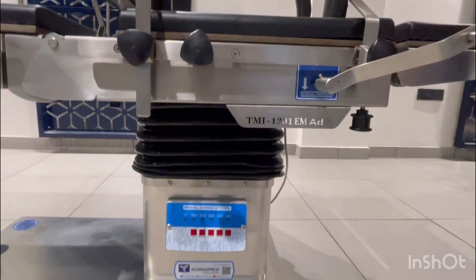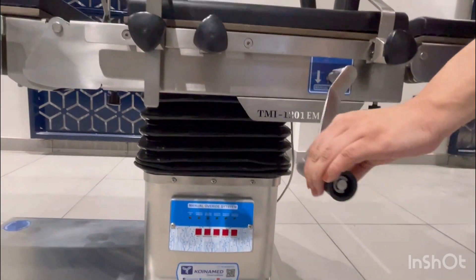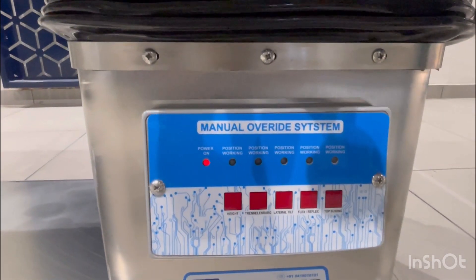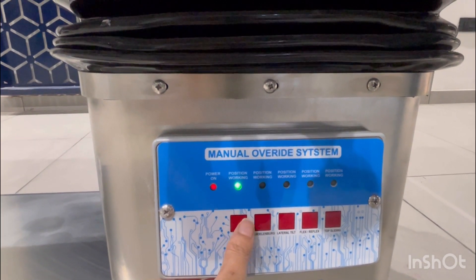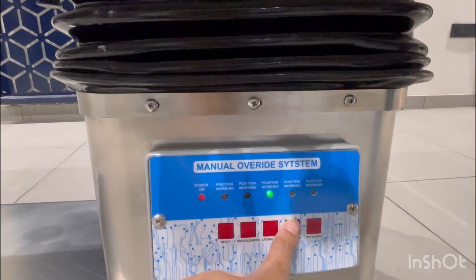For operating the override system, you have to slowly move the handle. Now you can see the power is on. You need to select the positions to operate the manual override system.